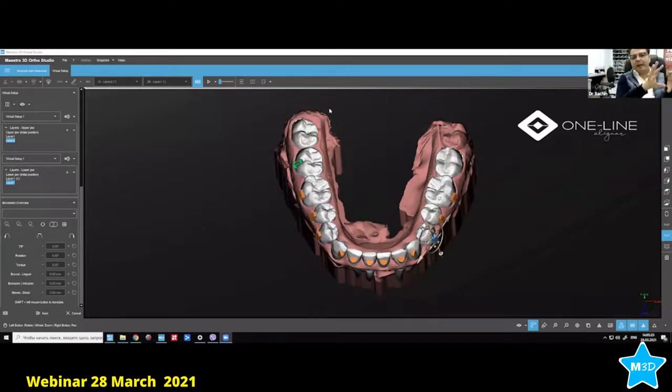With my protocols, the velocity which we use and the sheet, I think it's a combination of everything. It's a combination of the sheets, tooth size, root size, and attachments also. Yes, I can show you one case where we did a lot of retraction, and I'll show you what attachment we used on those. Okay, perfect. Are we okay with time? Yes, we have a few minutes, I think 10, 12, 15 minutes, roughly.